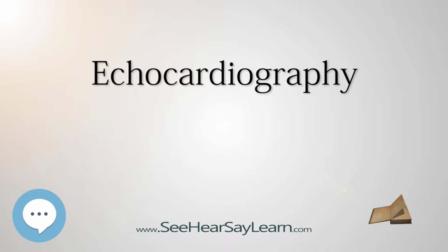The use of stress echocardiography may also help determine whether any chest pain or associated symptoms are related to heart disease. The biggest advantage to echocardiography is that it is not invasive, does not involve breaking the skin or entering body cavities, and has no known risks or side effects.